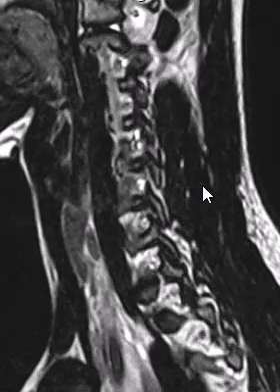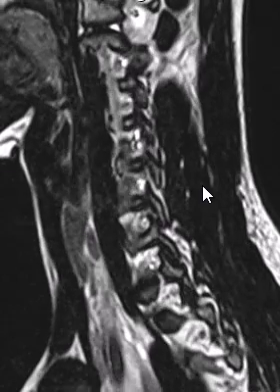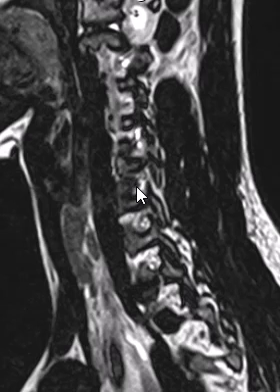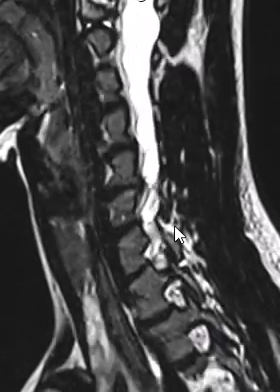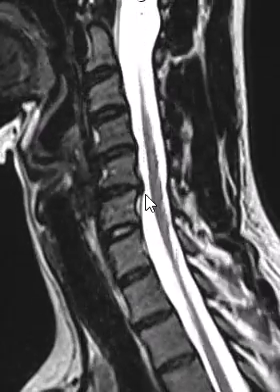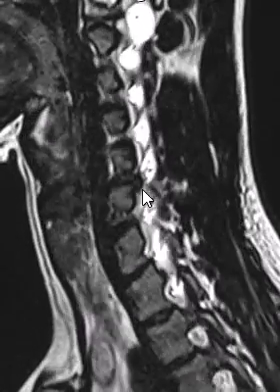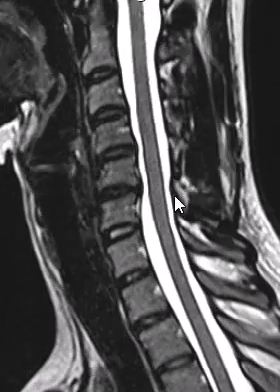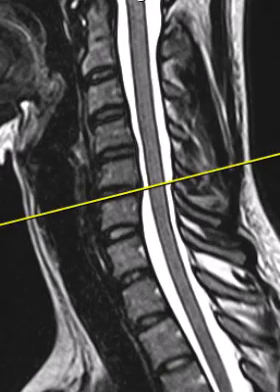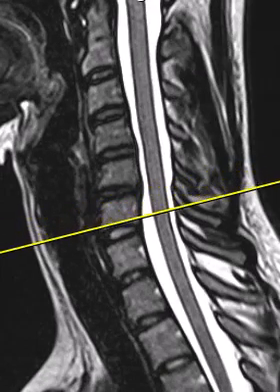Rolling to the left side as well, the disc on the left is not as bad, and the foramina are all wide open except for one side on the left. This patient had pain on the right, and the disc on the right pinching the nerve does explain that.